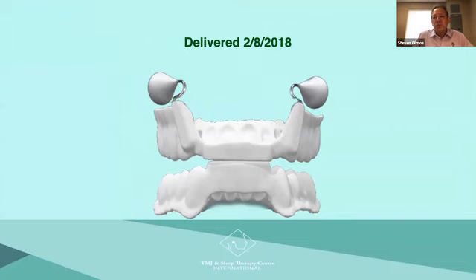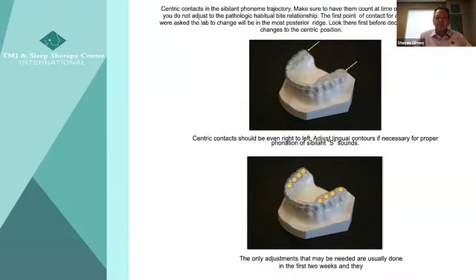At night, we use printed appliances like this. These have nasal dilators. They go underneath the nose, lift up like a Cottle's maneuver to open the valve. And then with nasal spray, we're able to shrink the tissue. And we use an anterior disc-guiding technique set to the phonetic standard, which is a technique I've published in the sleep literature as a way to find position for keeping airways open. And then we have a day appliance that she wears that's set to a phonetic standard so that speech is clear and holds proper orthopedic function.